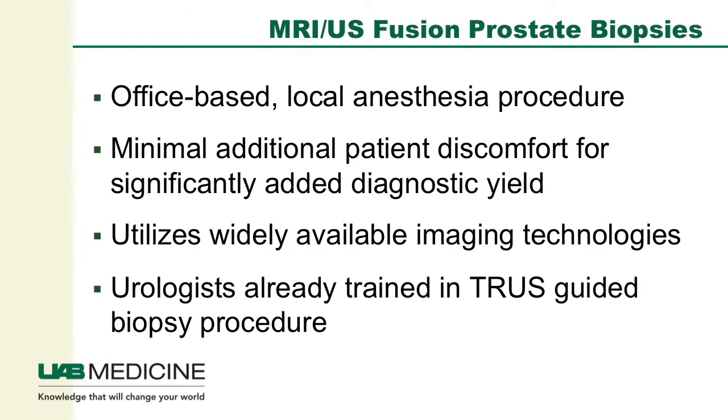So the MR ultrasound fusion-guided biopsies are an office-based local anesthesia procedure. There's minimal additional patient discomfort for significantly added diagnostic yield because we're now incorporating those MR images. It utilizes widely available imaging technologies, as Dr. Nix discussed. And urologists are already trained in transrectal ultrasound-guided biopsy procedures, which is their routine. This is all behind-the-scenes software fusion that allows for this higher yield in biopsy results.